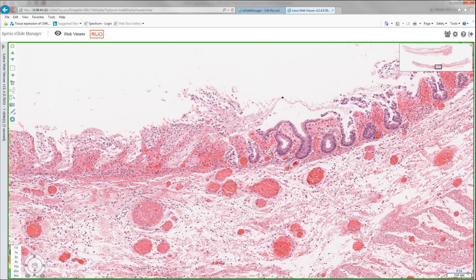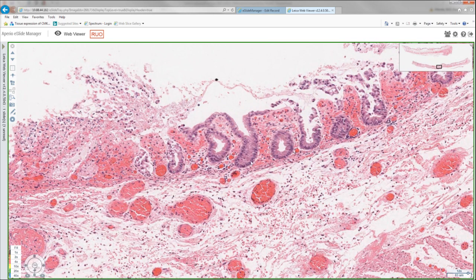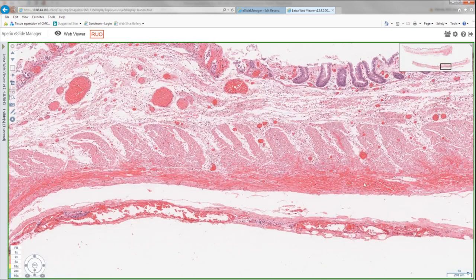And reactive mucin loss. If you remember the picture that I showed you earlier today with goblet cells, which is normal, in this case we have lost many of the goblet cells. The residual mucin is in very rare cells, so we have lost a lot of the mucin. There's sloughing of the epithelial lining into the lumen, and areas that become necrotic and ulcerated. As we move along, we can see that there are areas of intact mucosa and some areas that are more affected. Hemorrhagic changes can involve the full thickness of the wall.